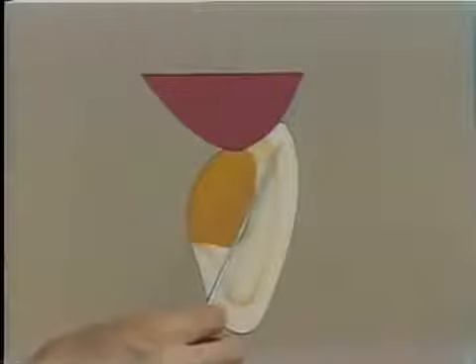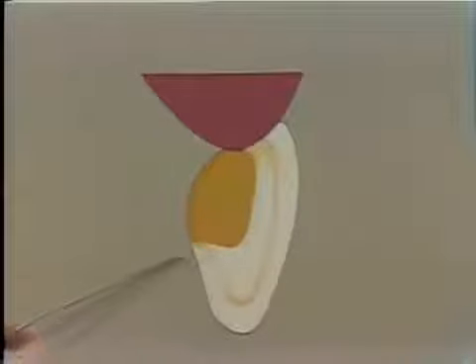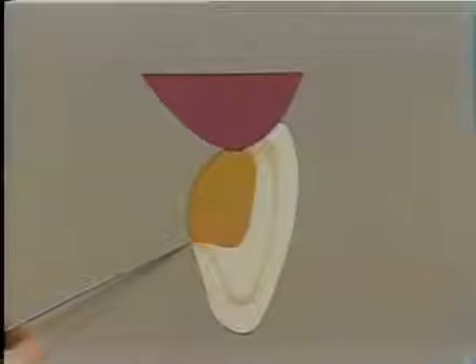There has to be a 1 to 2 millimeter thickness of porcelain around this area of the gold on the labial and on the incisal and onto the lingual surface. And notice how you have a feather edge as the porcelain tapers off to a fine edge, quite distinct from normal relationships of porcelain to gold. And the same thing happens all the way down here.